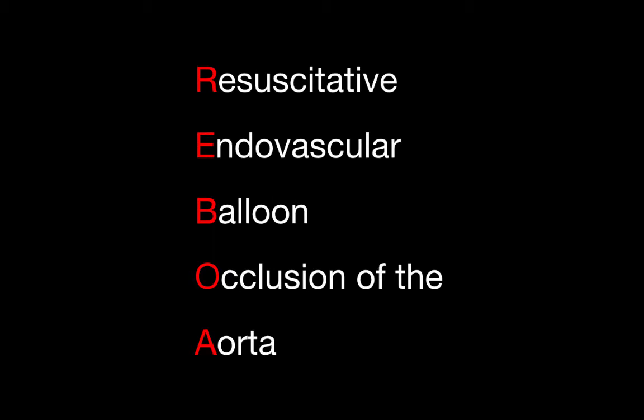So again, in the trauma setting, this can be very helpful. It is being done at some select trauma centers, particularly in the setting of pelvic fractures and occluding the aorta, allowing the pelvic fracture to be stabilized, and the balloon then taken down, or whatever the treatment algorithm.